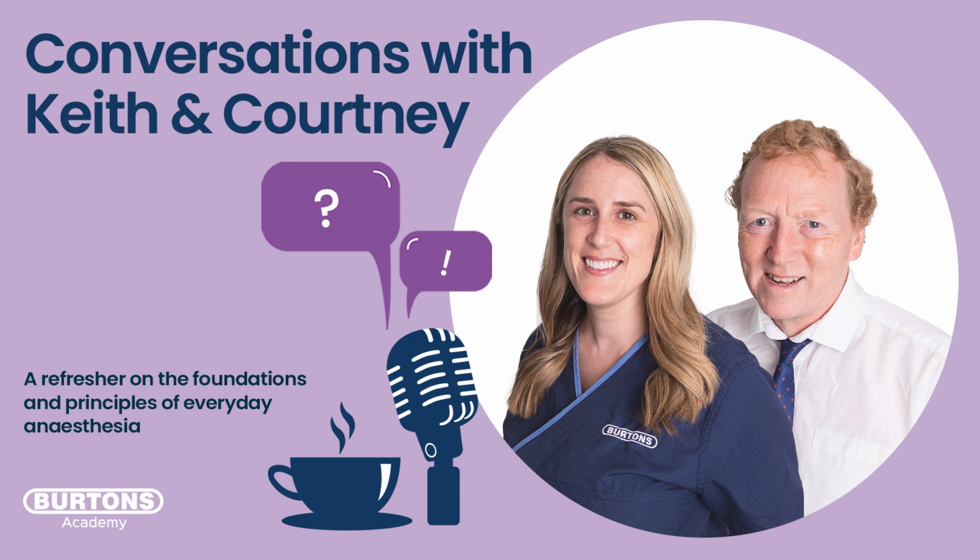But the main effect, the clinical effect that you would worry about, would be during the recovery. After about 10 minutes or so, you turn off your nitrous and you keep your oxygen on just to make sure they're getting it, and also I think it's good for our environmental pollution, ourselves in the theatre. But yeah, about 10 or so minutes they recommend keep them on oxygen after stopping that nitrous delivery.